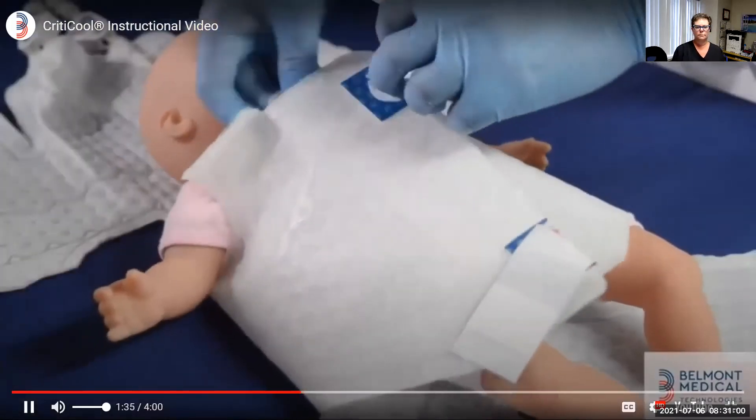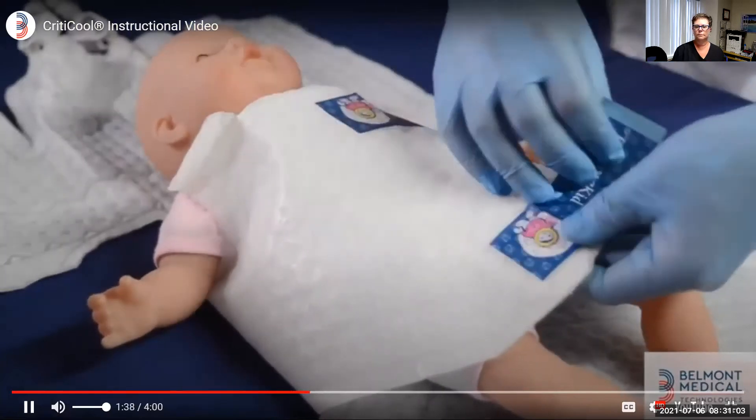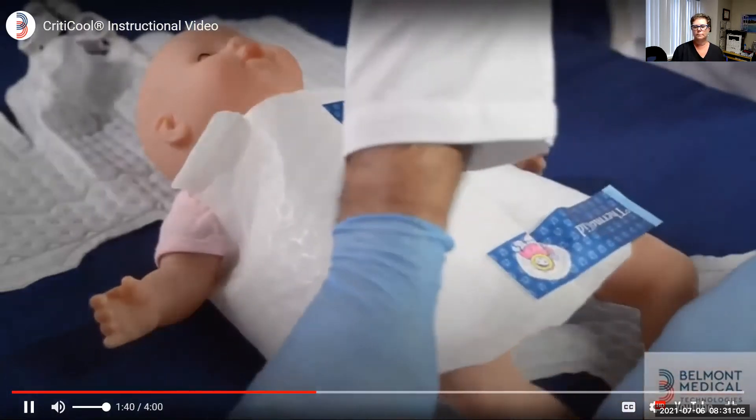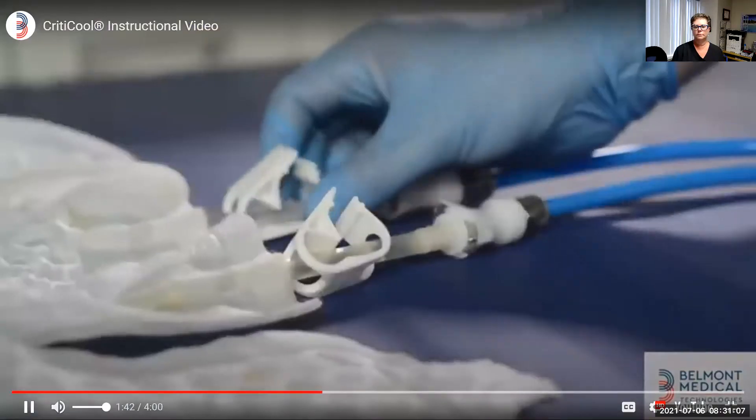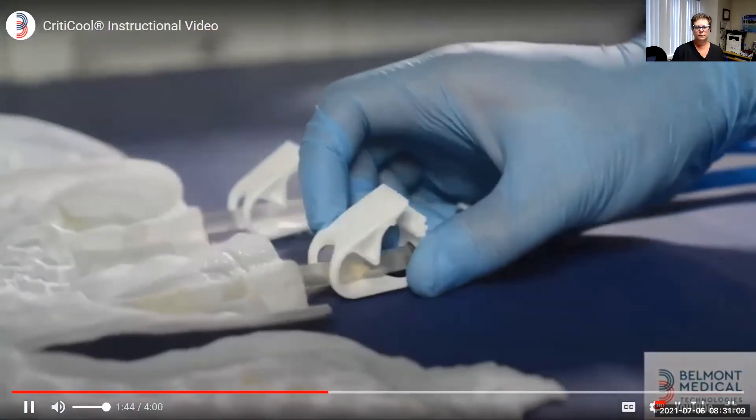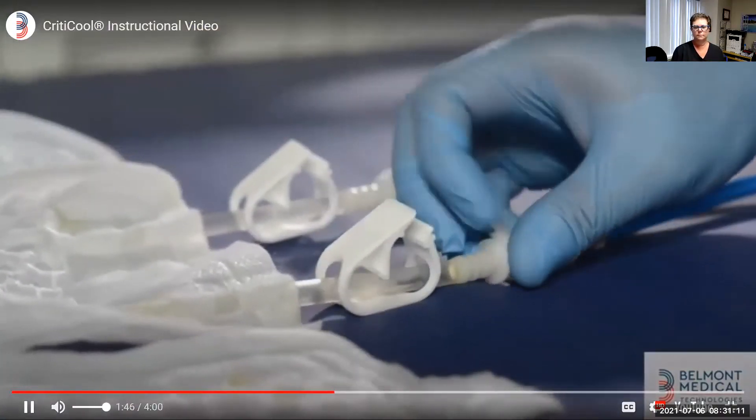Once the wrap is filled with water, secure wrap on the patient. Make sure to leave one finger breadth between the wrap and the patient. Make sure the clamps are open so that water will circulate through the wrap throughout the treatment.